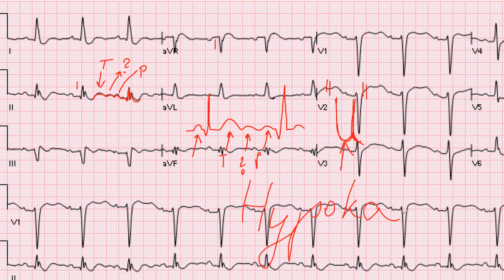Yes. You haven't watched the videos about the ion disturbances? I watched the hyperkalemia one. I watched all of them except this one. See? If you see a prominent U wave, that's hypokalemia. If you have a tall T wave, hyperkalemia.